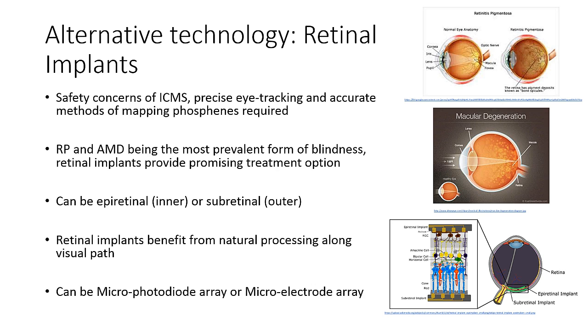Retinal implants, however, can also benefit a large proportion of the population, especially those suffering from retinal diseases like retinitis pigmentosa and age-related macular degeneration, as shown in the figures on the top right and the right middle. Retinitis pigmentosa is a degenerative disease that affects anyone from infancy to late adulthood, which affects the rod photoreceptor cells in the retina. Age-related macular degeneration only affects those in early to late adulthood, and it results in a loss of the visual field due to damage to the retina. Both of them have shown good results when being treated with a retinal implant.